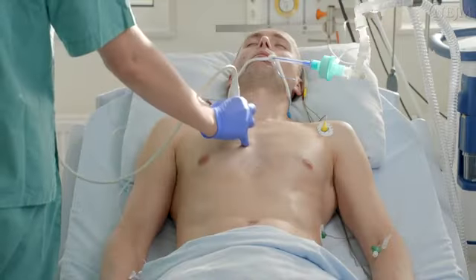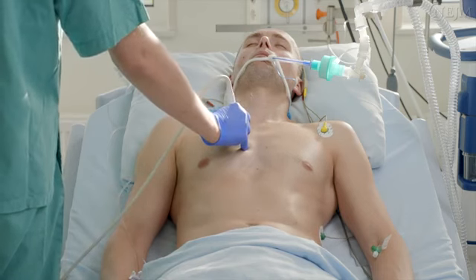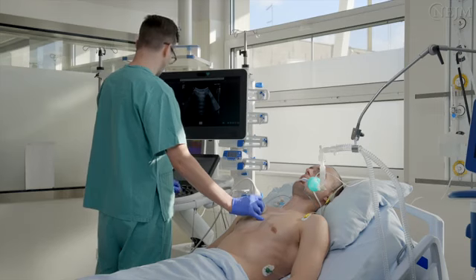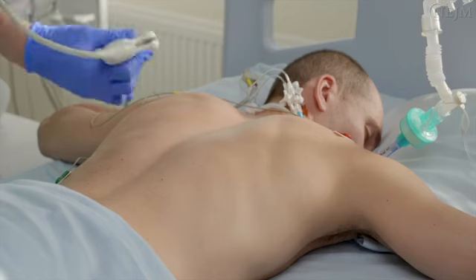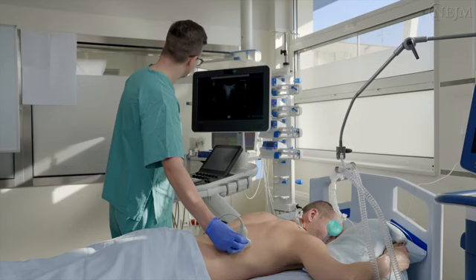For patients who are placed in a semi-recumbent or sitting position, including patients imaged while they are in the intensive care unit, you can perform the study without assessment of the paravertebral areas. For patients placed in the prone position, you may perform the exam without assessment of the anterior lung fields.